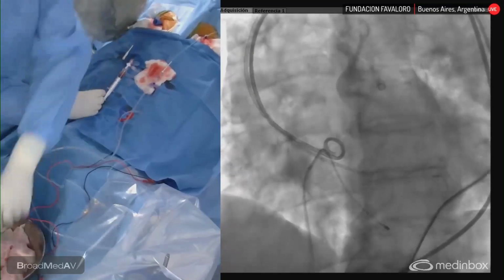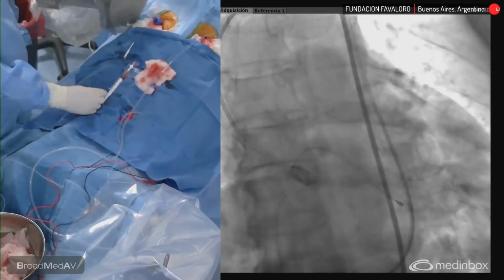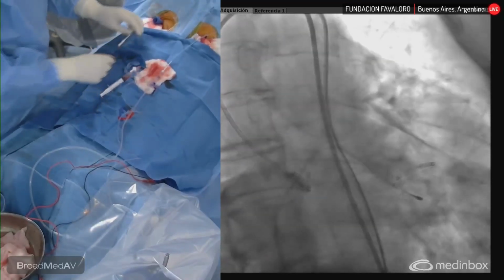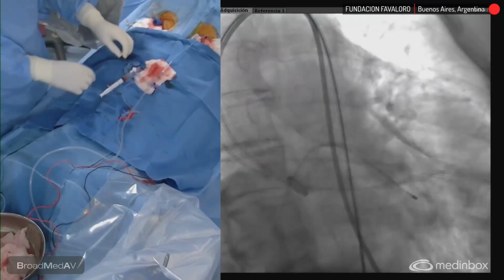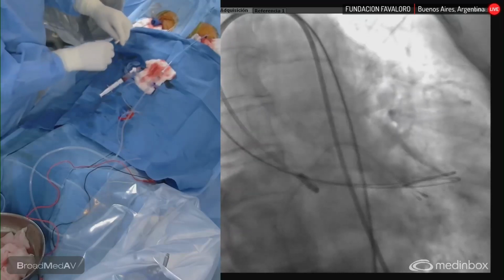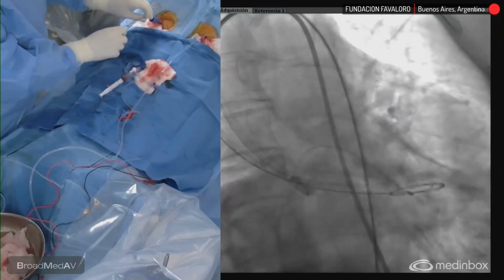So, let's go back, yes. Raise the pressure a little, Coto, because now we are going with the valve. So I imagine anesthesiology. Yeah. Dr. Mendes? Yes. Do you hear me? Yes, perfect. Rahil Begoswami asked if you use a single ProGlide or a pre-closure.